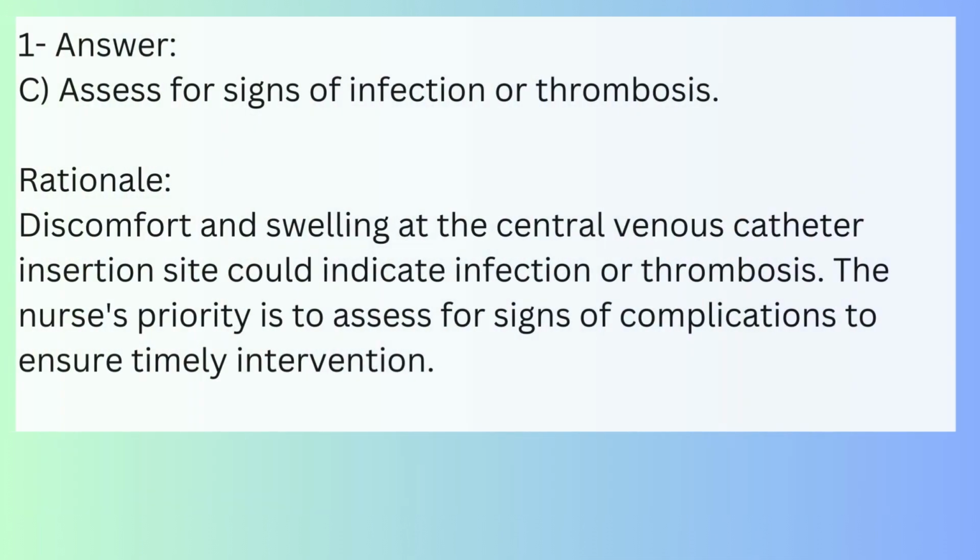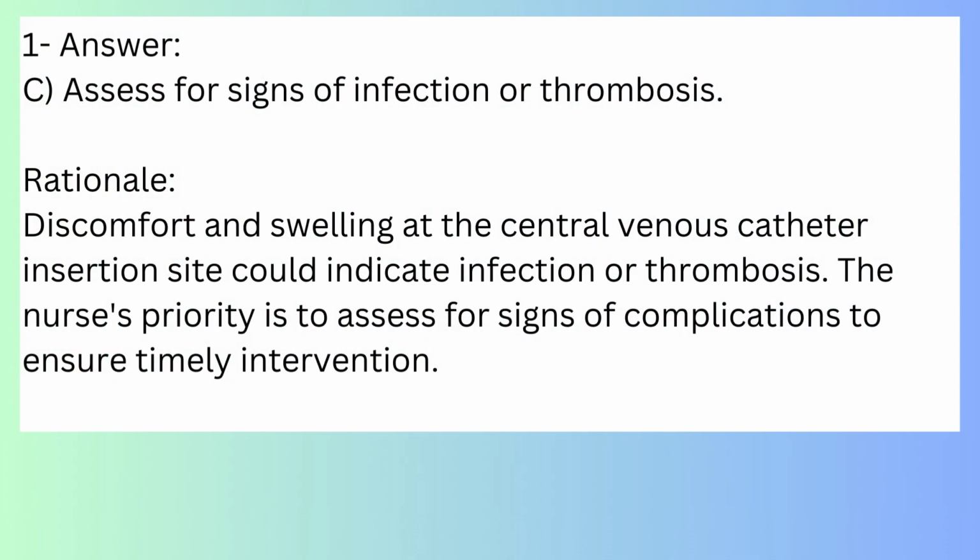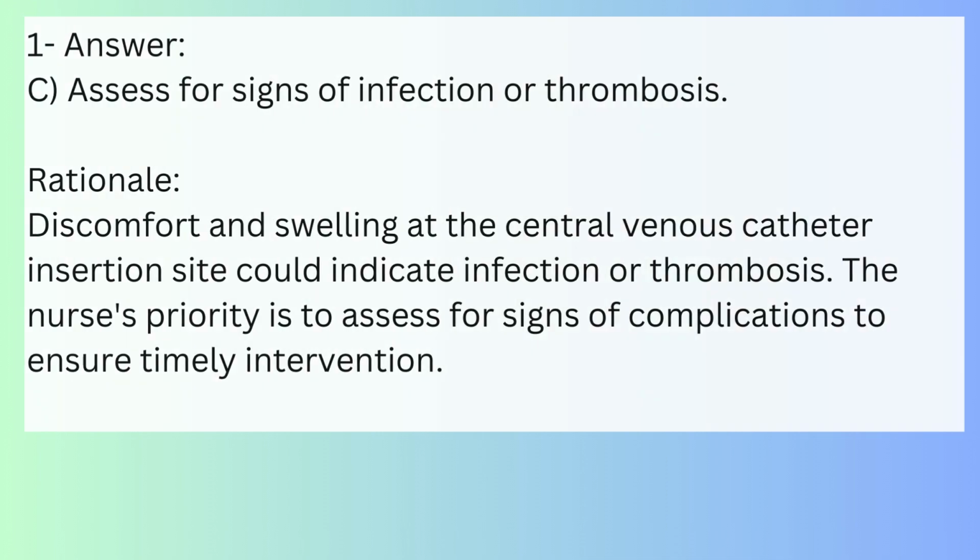Answer 1. C. Assess for signs of infection or thrombosis. Rationale. Discomfort and swelling at the central venous catheter insertion site could indicate infection or thrombosis. The nurse's priority is to assess for signs of complications to ensure timely intervention.